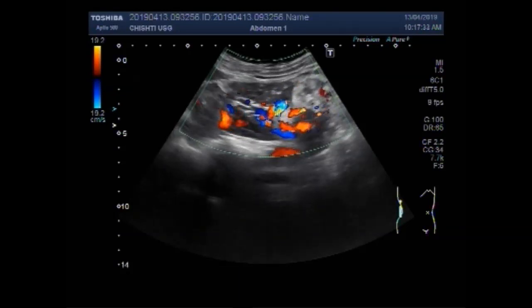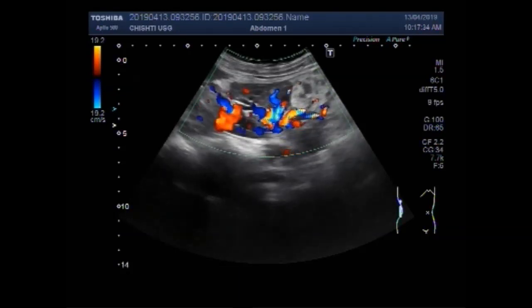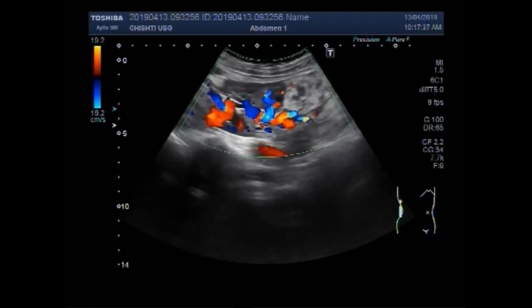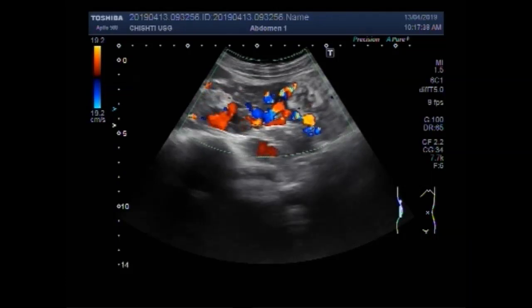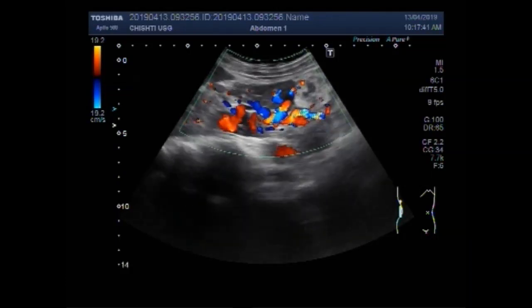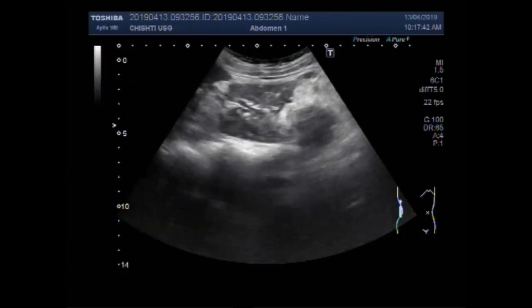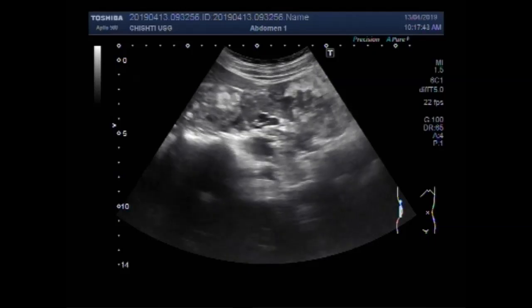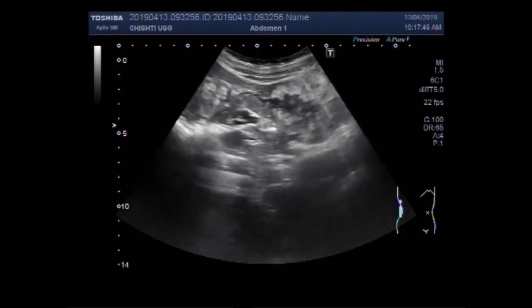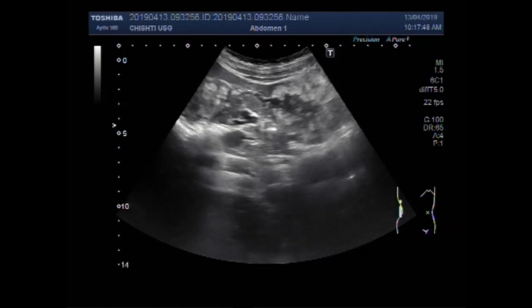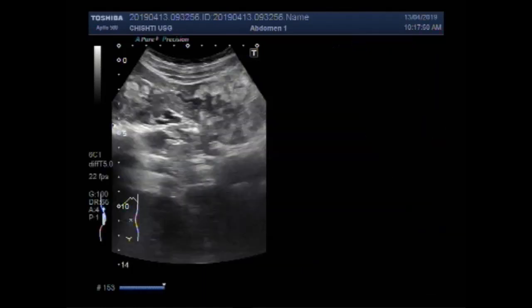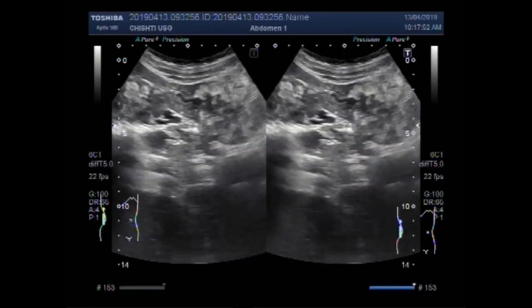You can see the blood flow in the kidney. The masses are almost avascular.